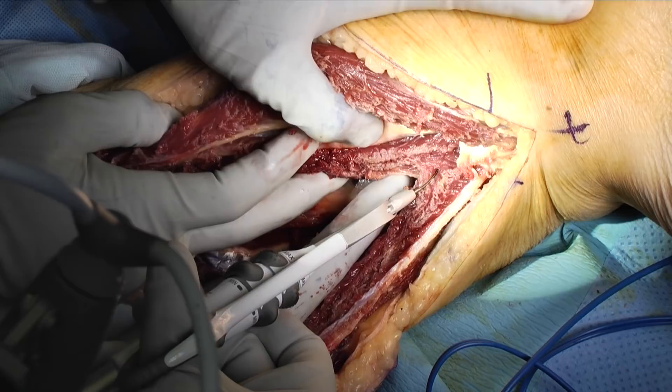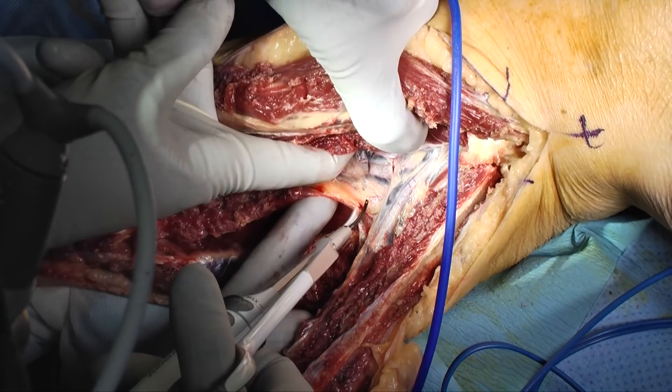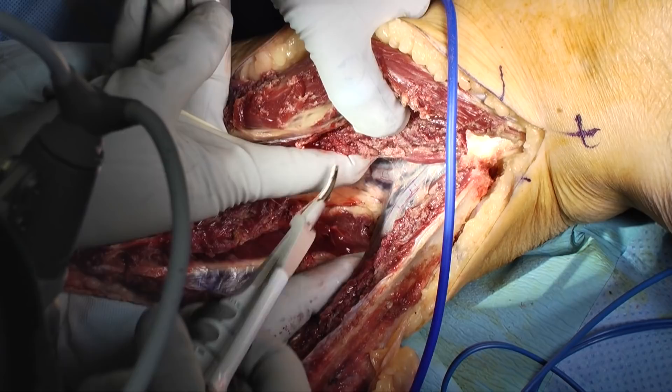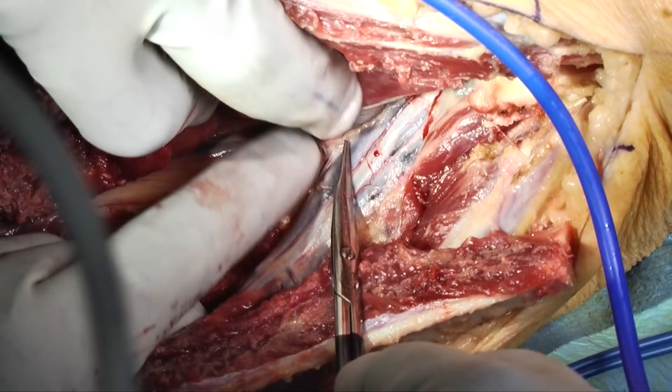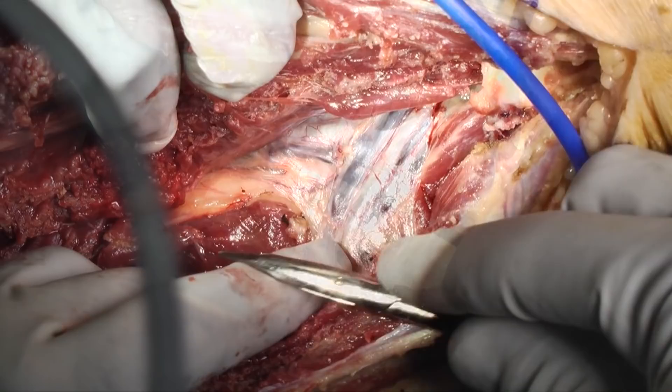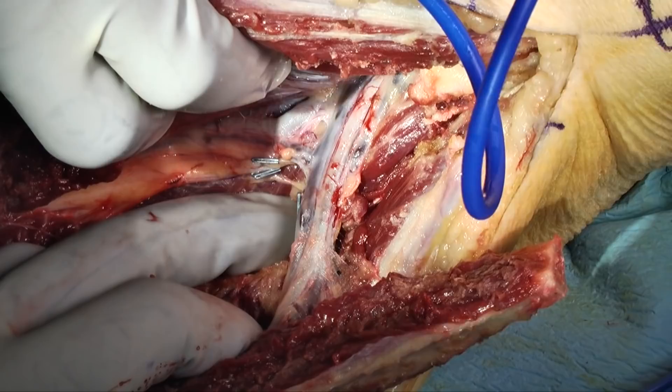The entire length of the posterior tibialis muscle is divided up to the proximal bone cut, at which point the flap is only pedicled on its vasculature. Any perforating vessels coming off the peroneal medially are divided, and the fascia overlying the artery and vein is divided to allow individual clamping and tying. All of this has been done under tourniquet time, which should be kept under an hour and a half to prevent ischemic changes to the lower extremity. After isolating the vessels and dividing the fascia, the tourniquet can be released and the flap allowed to reperfuse.